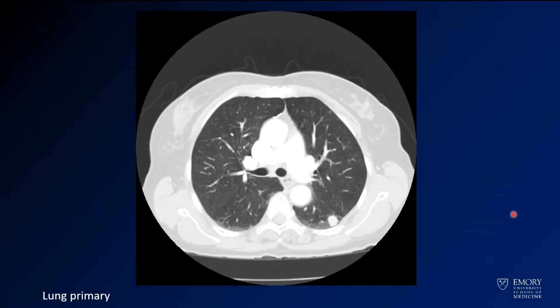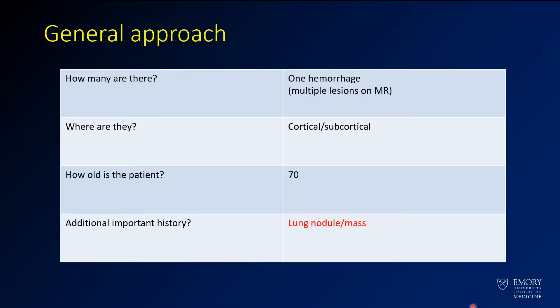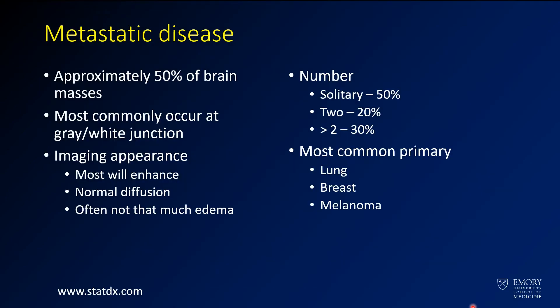In this case we have a chest CT. They have a mass here in the left lung. So this is concerning for a primary malignancy, which makes this much more concerning for metastatic disease. This is a case of metastatic disease.